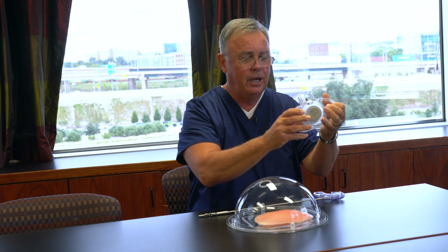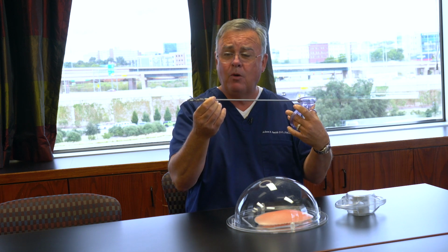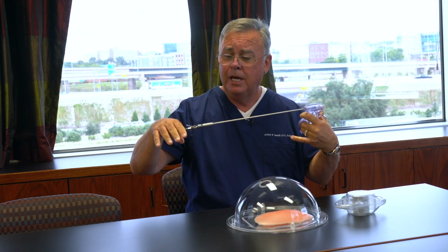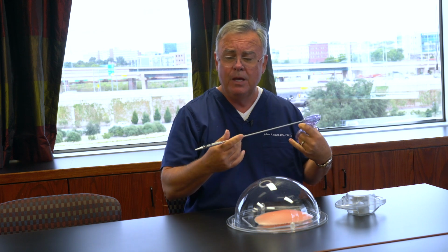This is a really powerful magnet that's sealed in a plastic case that can be covered with a sterile drape. This is the device that has been developed that is basically a grasper that we can grasp tissue with. In particular, for our purposes, we tend to grasp the liver. It's atraumatic, which means it doesn't hurt anything. You can clip it on anything you want. It doesn't do any harm to the tissue, and it allows us to move tissue around.